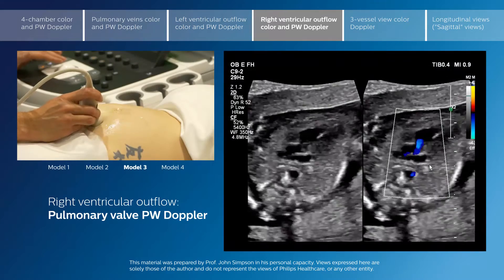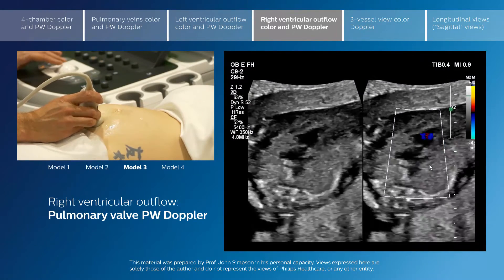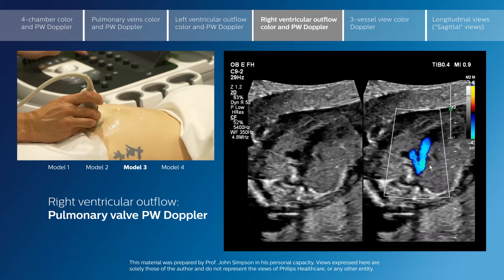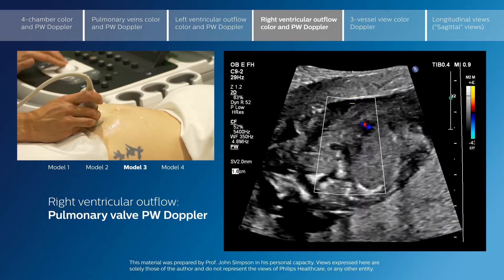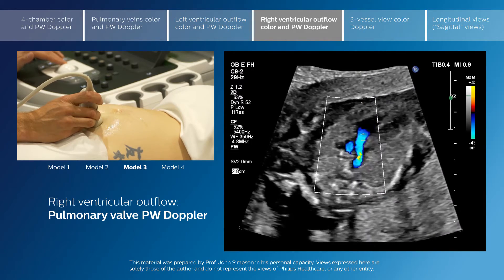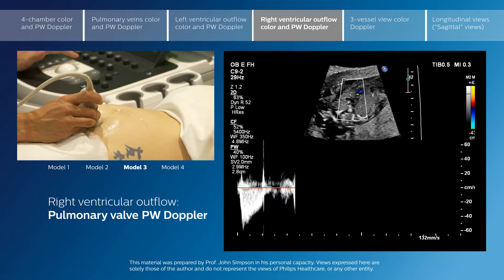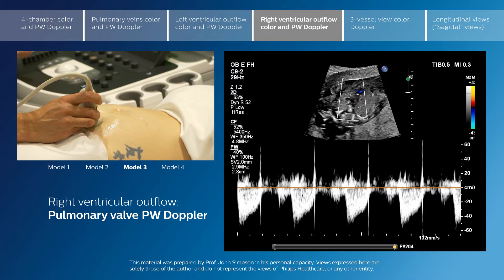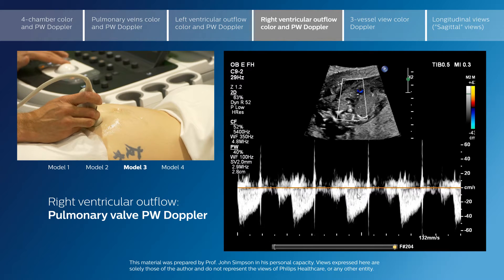This would be an excellent position for Doppler interrogation of the pulmonary valve because the flow is heading directly away from us. So we can interrogate this with use of pulsed Doppler placed just distal to the pulmonary valve, and here we see a typical shape of the pulmonary signal with a very sharp acceleration time upstroke and an asymmetric chase, often with a little notch in it.